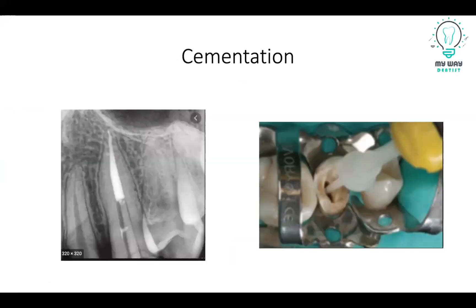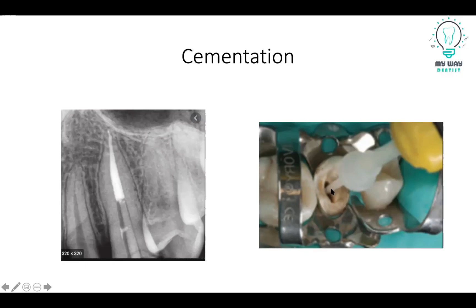After doing the enlargement for the post space, you will take a radiograph to make sure the post is reaching the full length until the apical seal. We need to emphasize that this radiograph shown is just an example and is not perfect. After making sure your post is reaching the full length, you will remove the post and clean the canal. It's very important to make the canal dry before putting the cement. You will put the tip of the cement inside the canal going back until you reach the orifice, then put your post and do the light curing.